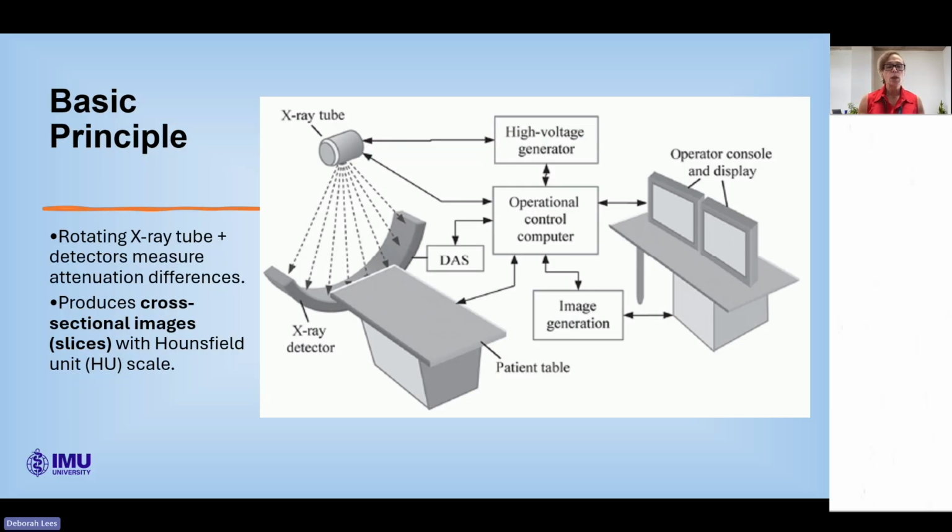And the operator can also control how the slices are actually presented. So making sure that, if we're looking for a true orthogonal, we can get a good 90-degree plane to the image that we're looking at, both in the longitudinal, the axial, the horizontal, the coronal. Depending on which image that you're looking at, the operator can fine-tune that quite nicely.